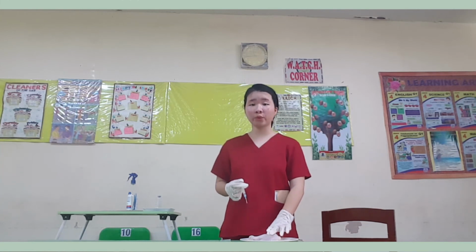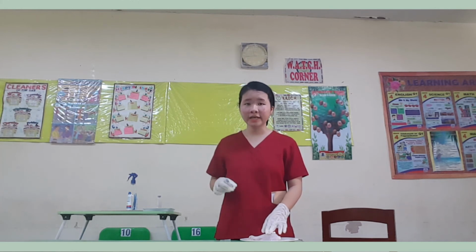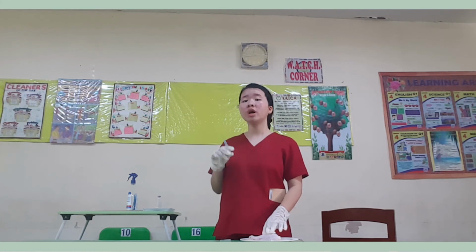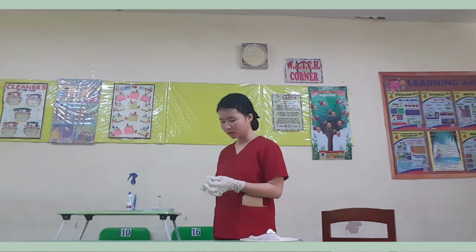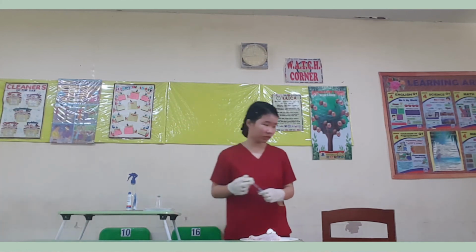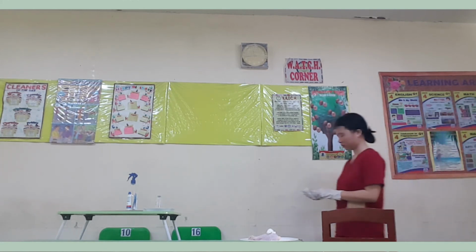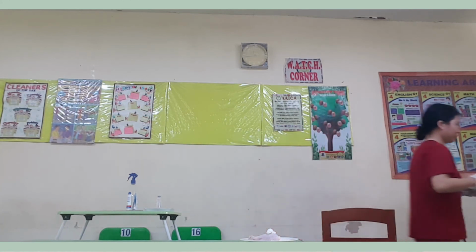For procedure number 24, do aftercare and discard the needle in a puncture-proof container. This ensures cleanliness and orderliness and prevents contamination. And after that, put it in the container. Like this one. And now we're going to dispose this.